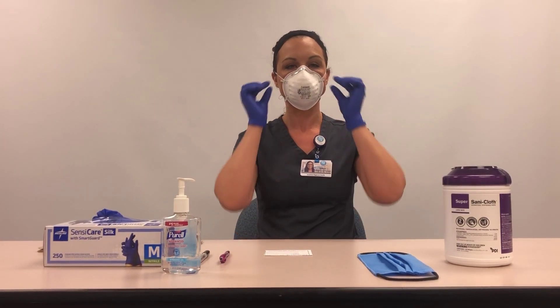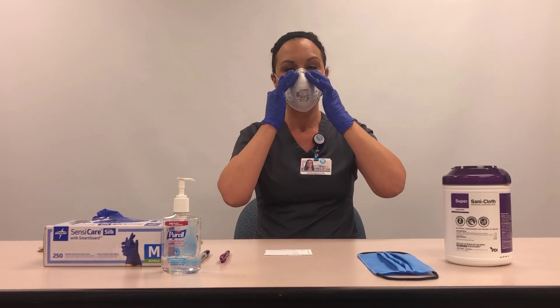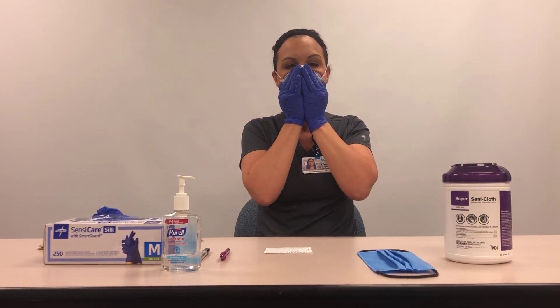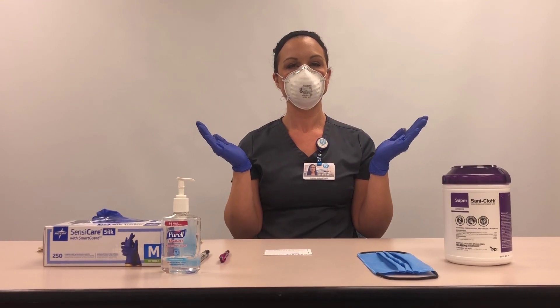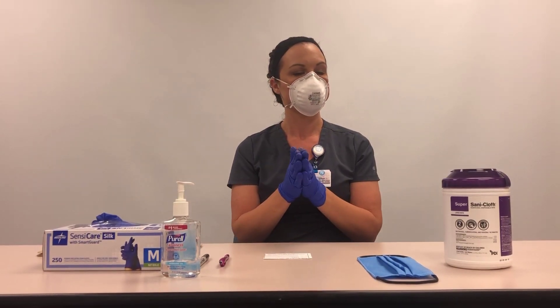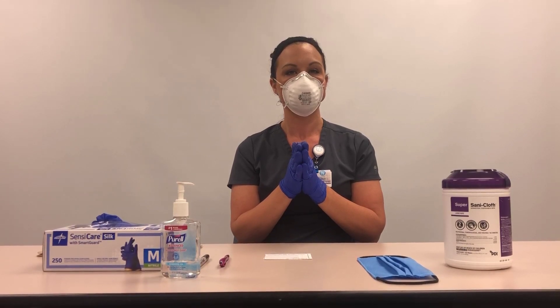If necessary, readjust the straps along the side of the head or remold the nose piece until a proper seal is achieved. If a proper seal cannot be achieved due to air leakage, the respirator cannot be used for airborne level of protection. Obtain a new respirator.